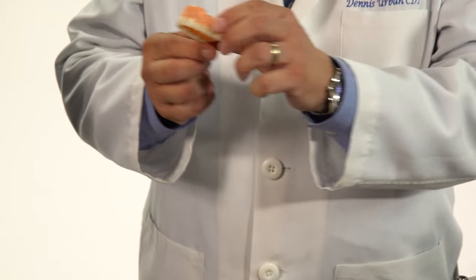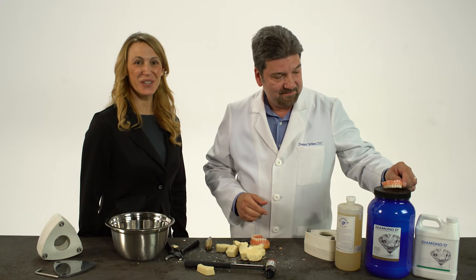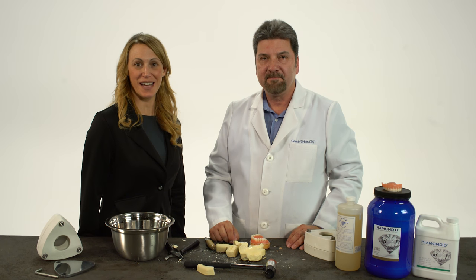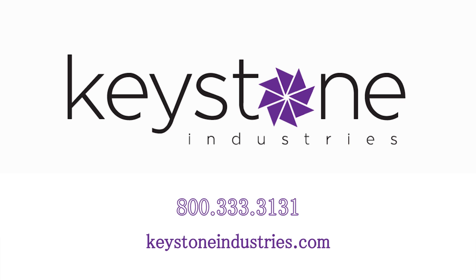This is how the finished denture looks. That looks great, Dennis. Thank you. You can get more information about Diamond D Denture Acrylic and Keystone's Microwave Techno Flask, and order it online at KeystoneIndustries.com, or call us at 800-333-3131.